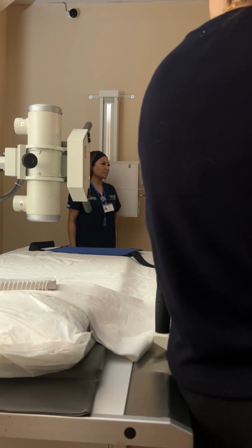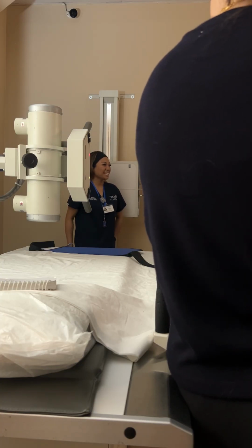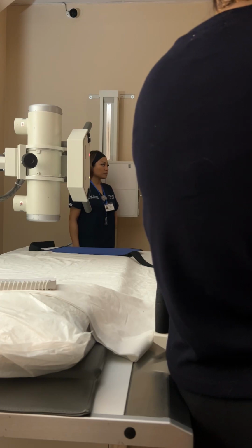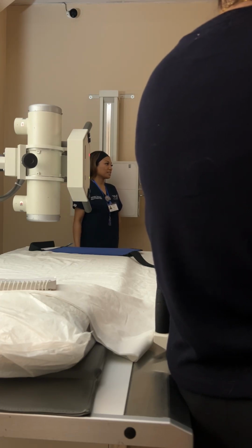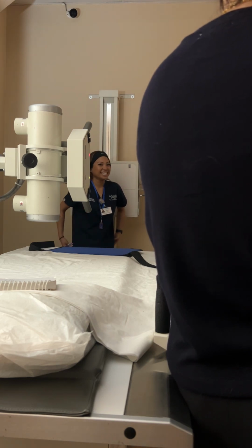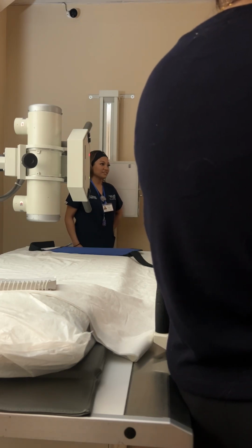Two tips for you, okay? Make sure that your patient rolls their shoulders forward. Also, I don't want to see this light up here, so let's bring that collimation down to the size of the film. Great. Centered on the MSP. Where's your marker? Don't forget, get used to putting your markers on there. If you need tape or sticky stuff, it's over there. Be sure you're throwing a marker up there, and you put a shield under too, right? Great. Next.